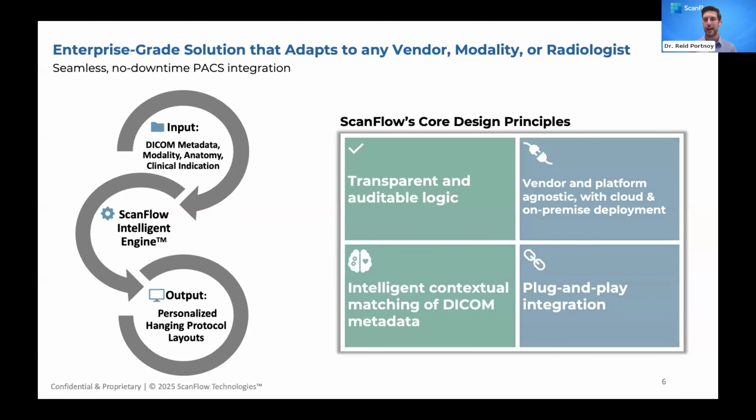We are transparent and auditable. Yes, we are AI enabled, but our code, there is no black box. We know exactly what our code is doing every single step of the way. That way we can deliver consistent hanging protocols to our radiologists without fail.